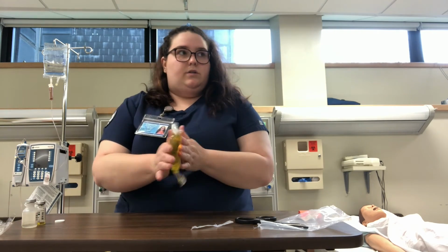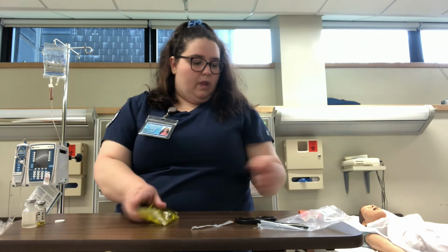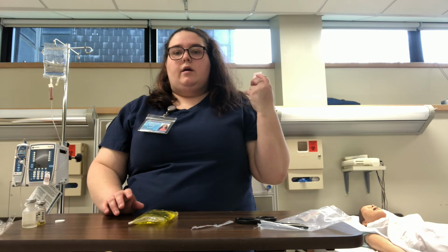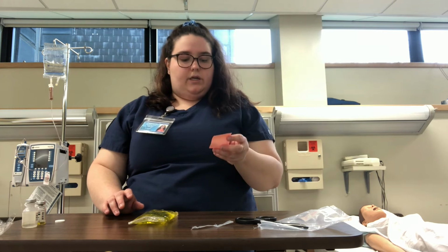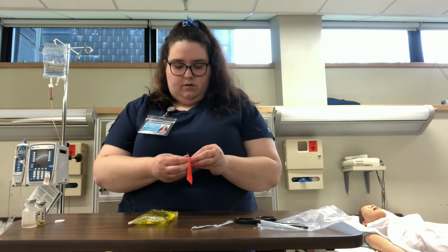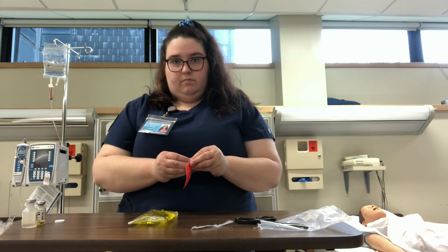I'm gonna swish this around until it's distributed. I'm going to put a label on it. On the label is the medication I'm giving, the dosage, the date and time, my initials, and a patient label. So I'm gonna stick this on, and then I'm going to head to the patient's room.